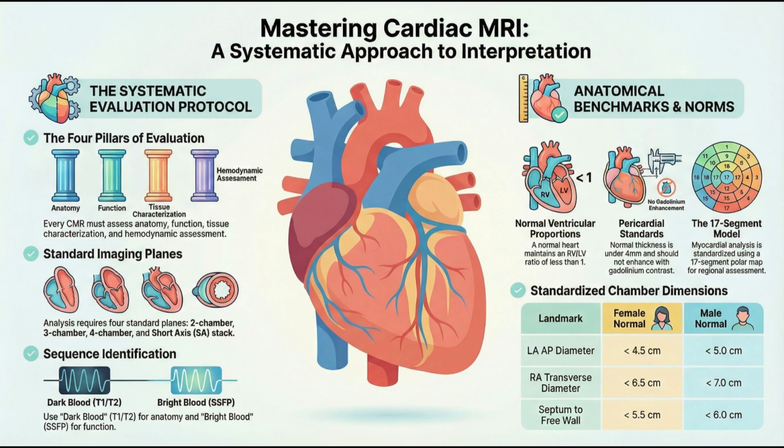Now, the paper mentions a third long axis view, the three-chamber view. This feels a bit more unique to MRI and echo. What's that adding? The three-chamber is special because it captures the inflow and the outflow in a single plane.